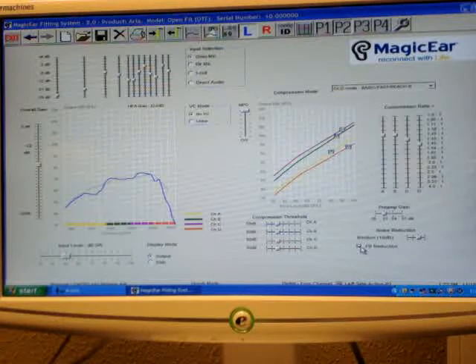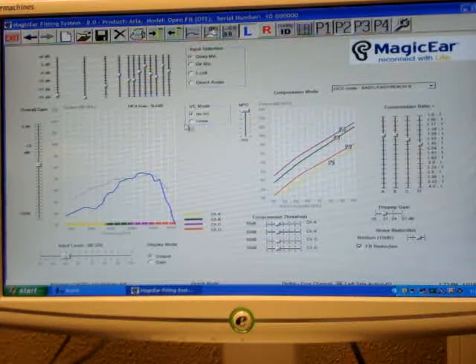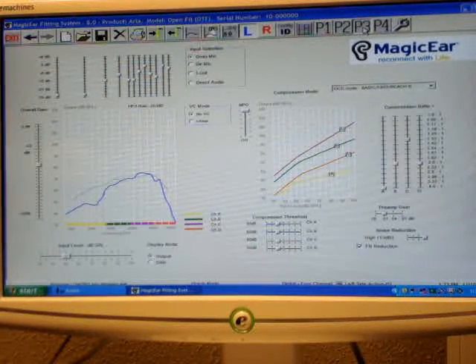You also have your feedback reduction to automatically reduce the feedback, or you can come to the graphic equalizer and it'll indicate which frequency, and you can click on it and lower it, and it'll automatically adjust the frequency at that setting. So you can fine tune each individual memory. We can go to memory 3.